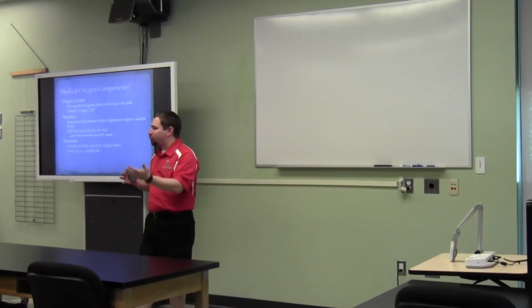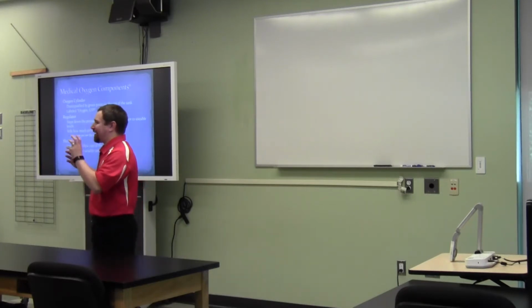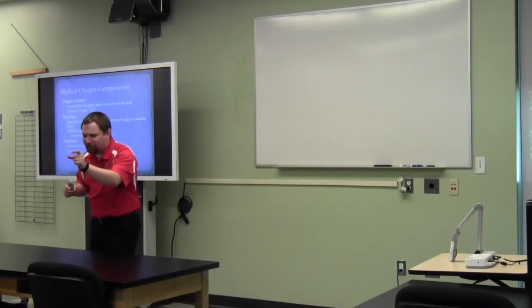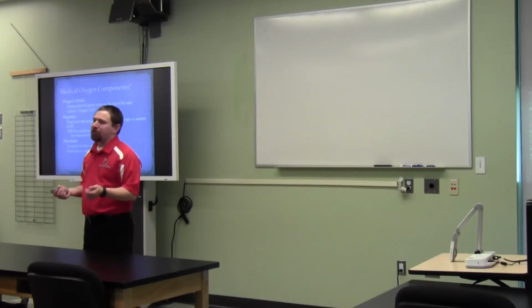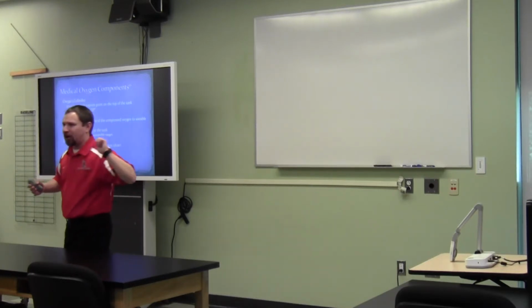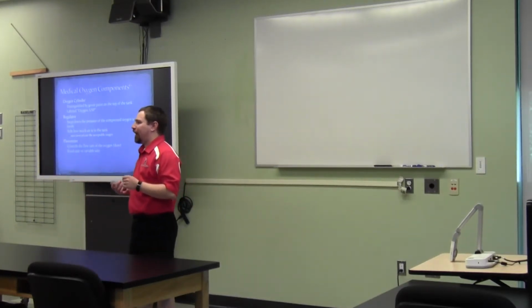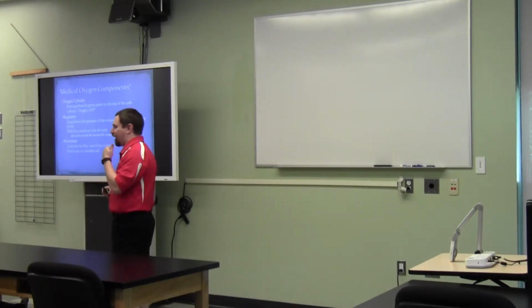Things from Medcos and sports health tend to be fixed rate, pretty much high or low. There's no guessing of like, oh, I'm going to adjust it here. It's kind of a set value, like a stim unit on presets. I'm going to put it on pre-mod, and I'm just going to turn the thing on and walk away, as opposed to fiddling with the individual components, which we didn't have with variable.